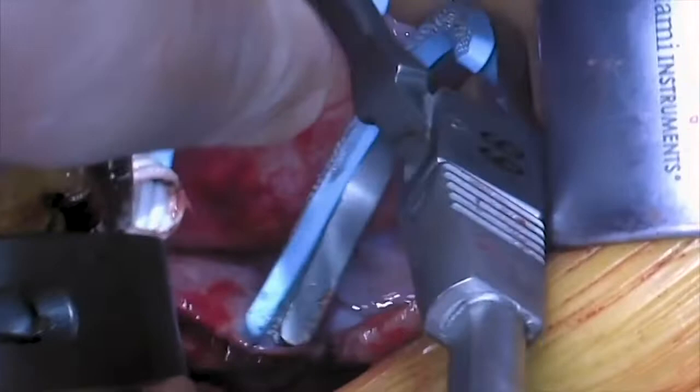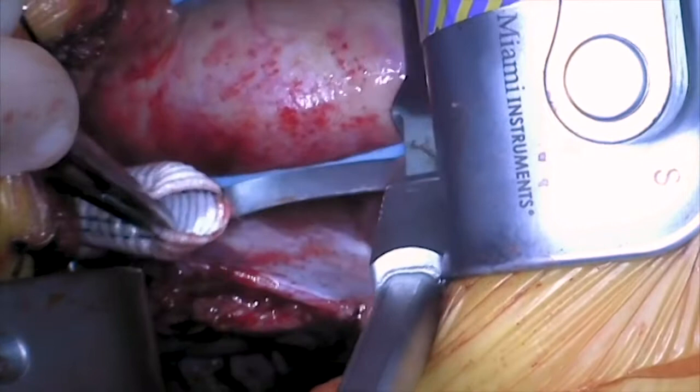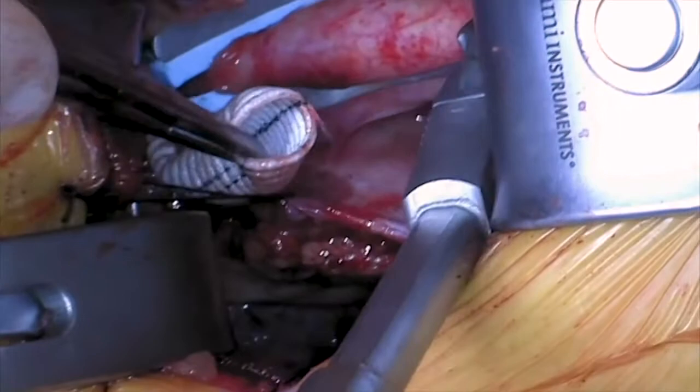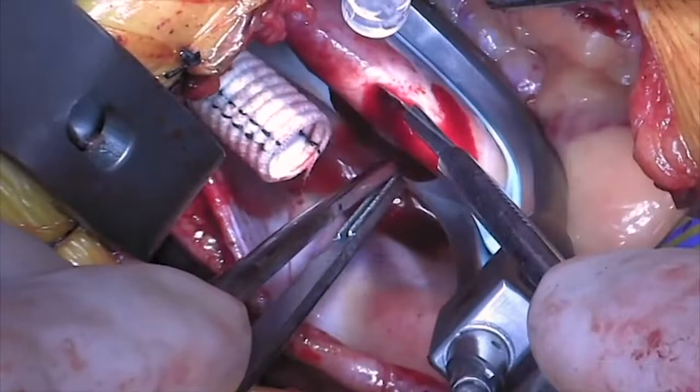Demonstrated here is an 8mm Dacron graft, which has been passed through the retroclavicular tunnel. A side-biting ascending aortic clamp is applied to maintain distal flow. A longitudinal arteriotomy is subsequently made and extended with Potts scissors.